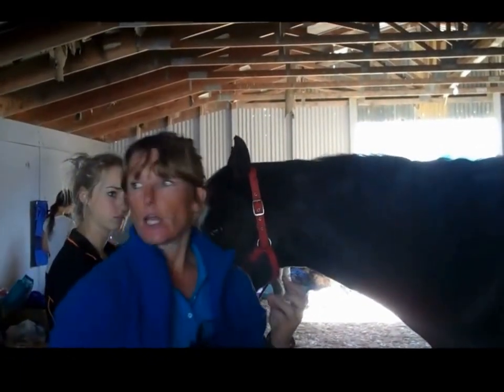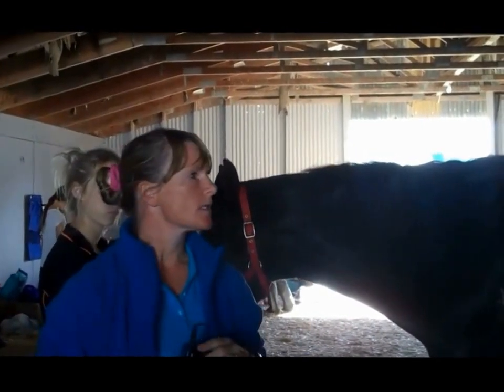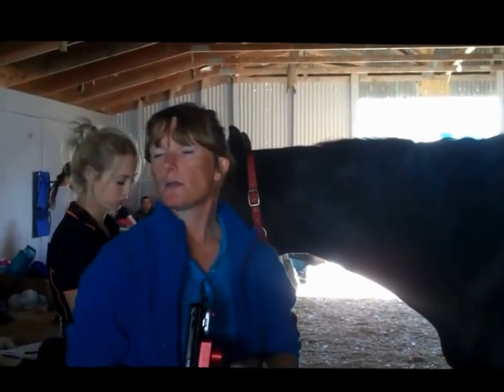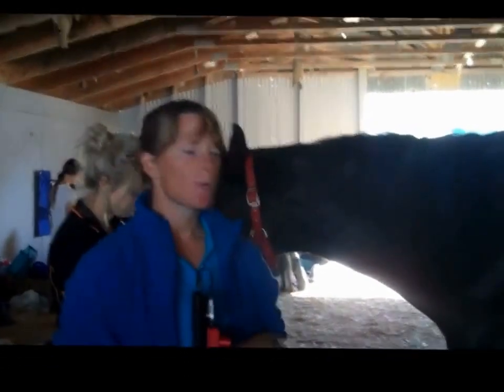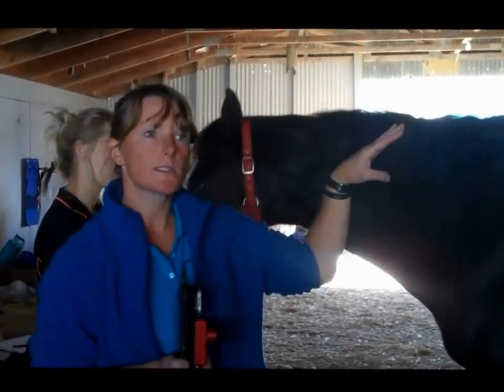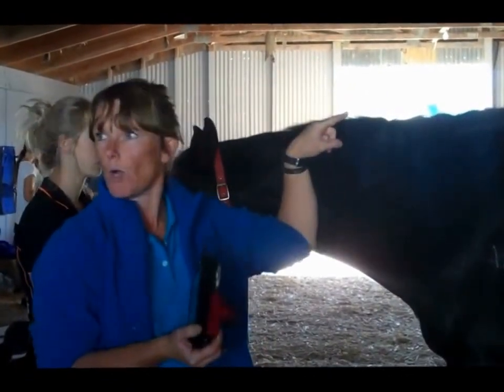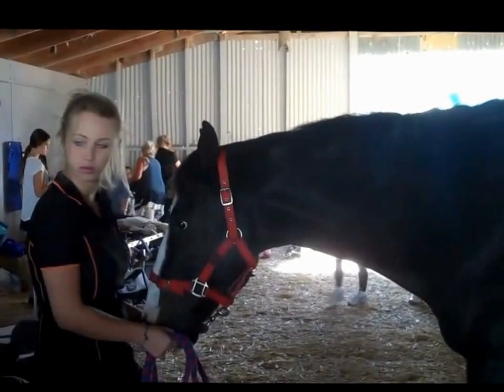Mainly I use it for problem horses — when someone gets bucked off their horse and they don't know why. What it will show is we can basically scan the whole horse. I can stand on a ladder and look at the whole back, and then I'll just grab a picture.